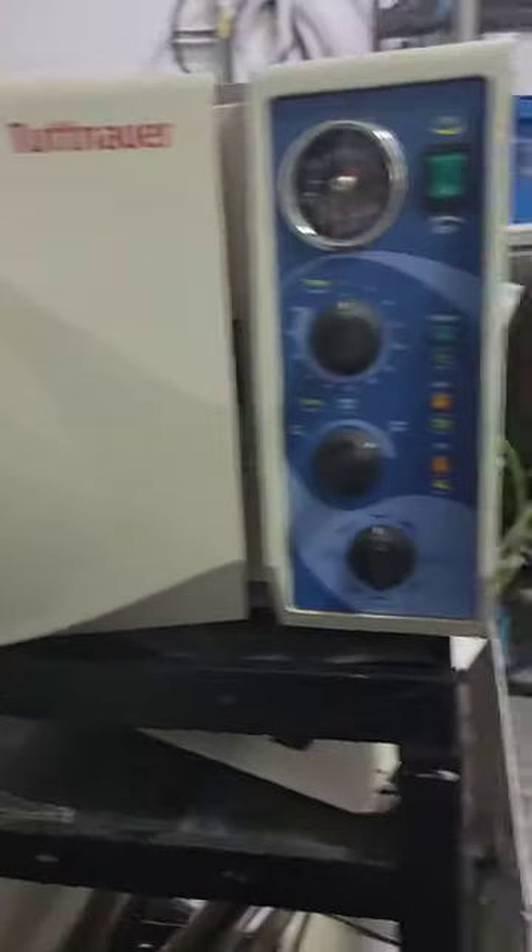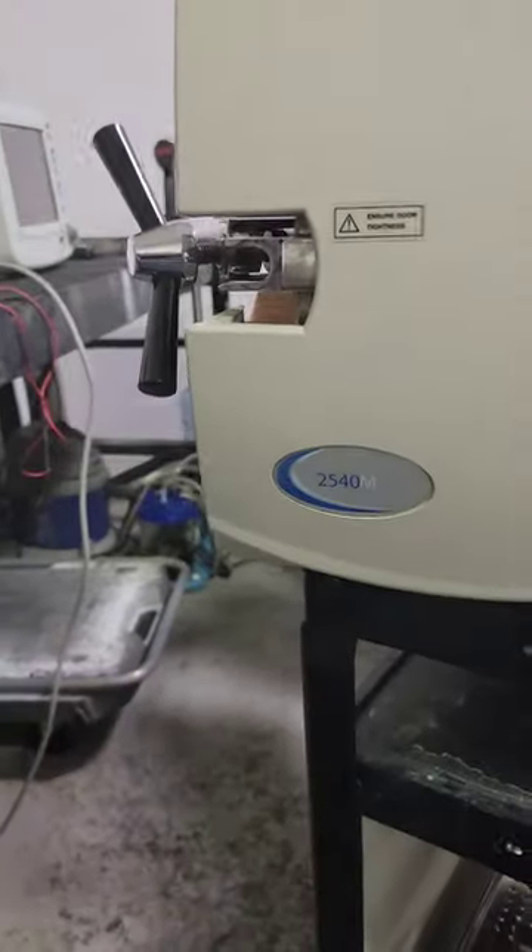How to use the Tuttnauer 2540M, or any M-Class Steam Sterilizer.